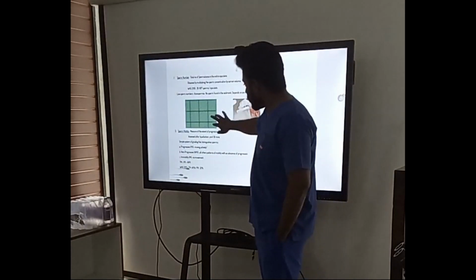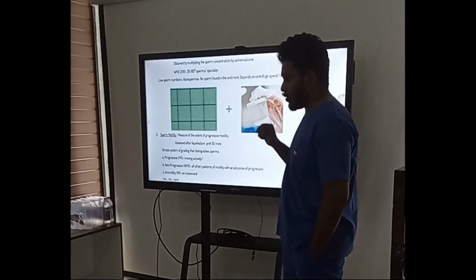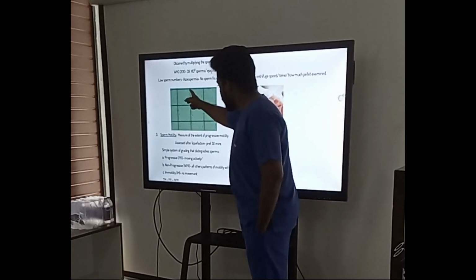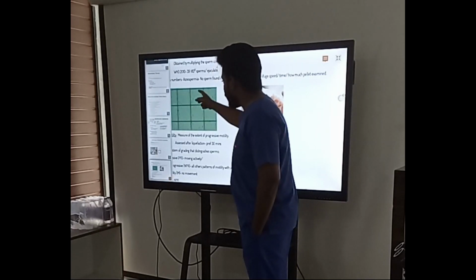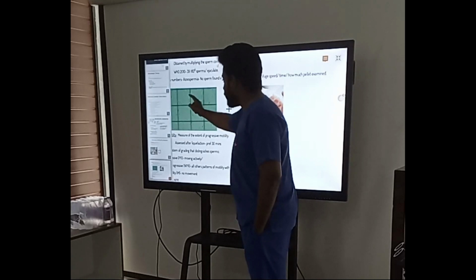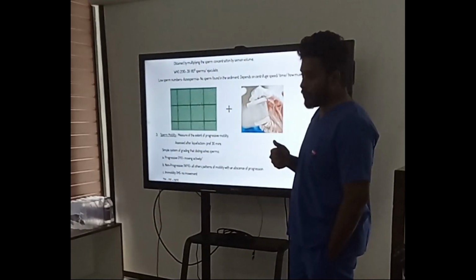This is how it will look. So it will be constantly moving. So we have this cell counter to tap on whenever, as and when you are seeing in the chamber. So majority we will prefer one triangle of either side, so that even if a sperm moves from this side to that side, we will not be counting two times.